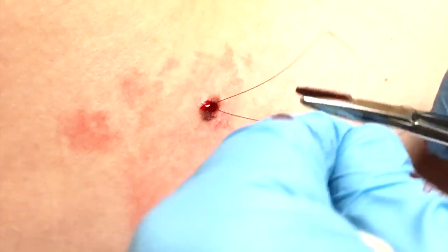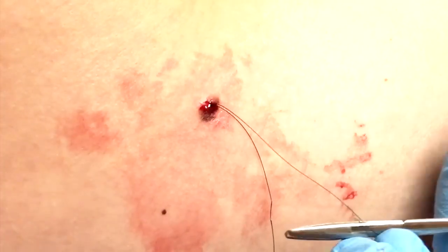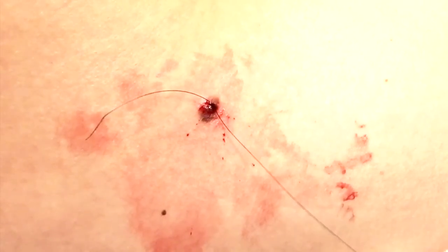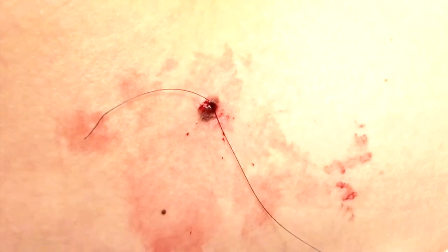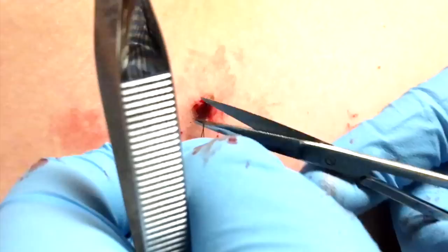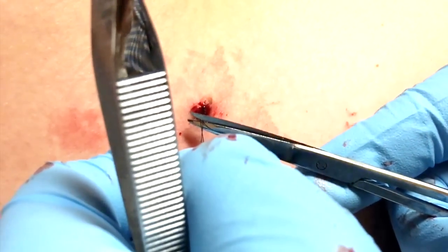It's so weird that I literally can't feel any of it — it's wild, right? And you are set. These sutures do need to be removed in about seven to eight days.